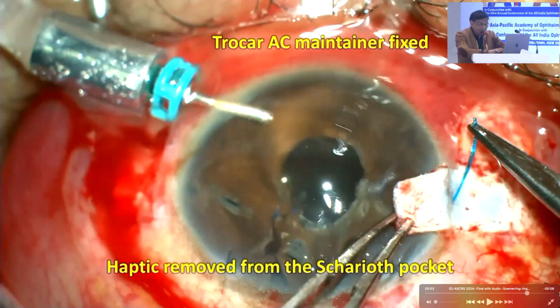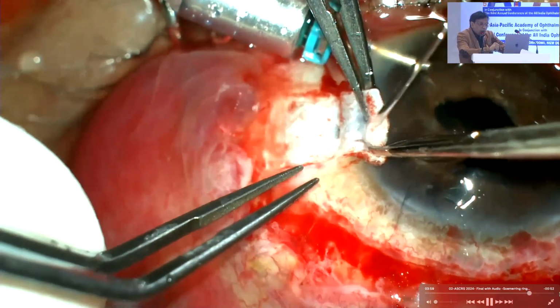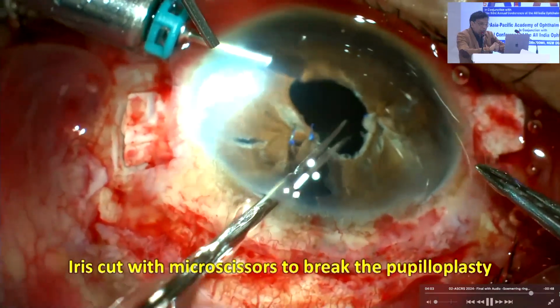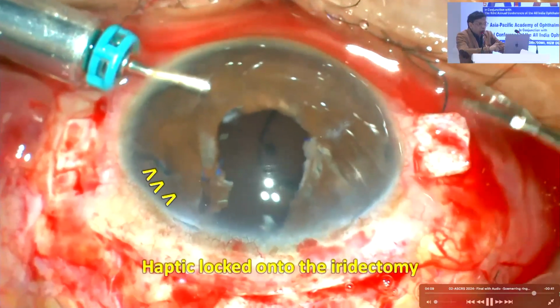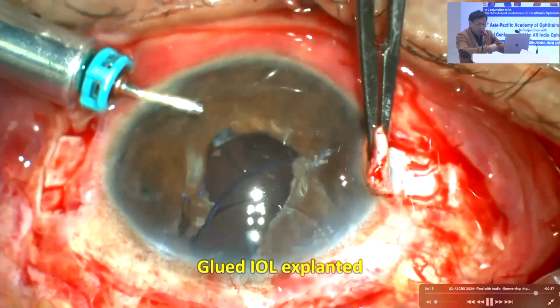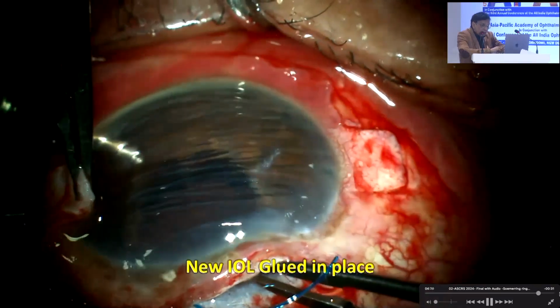Refer to AMAR. So now I have dislodged the haptics. This is just 1 week post-op, okay? And now I've dislodged the haptics. Now my problem is I take a scissor and I'm cutting this pupil. So I've enlarged it because I know I have to take it out. Now look what's happened to that haptic. It's got stuck in the iridectomy there. I'd created a peripheral iridectomy, remember there? So it's got stuck there. So I had to dislodge it. Now slowly take it out.